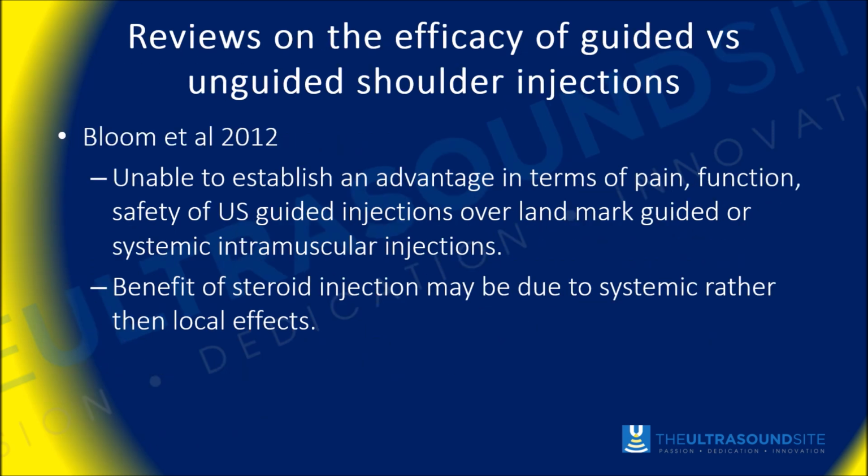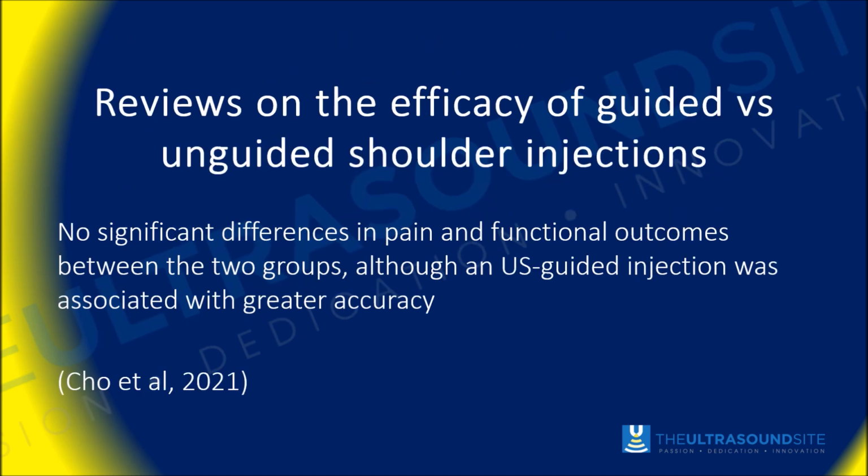And there are other reviews where there were much less obvious advantages, or the conclusions were less clear cut around whether or not guided injections gave benefit.